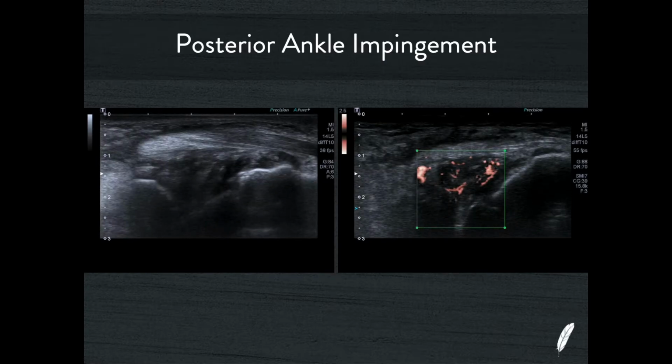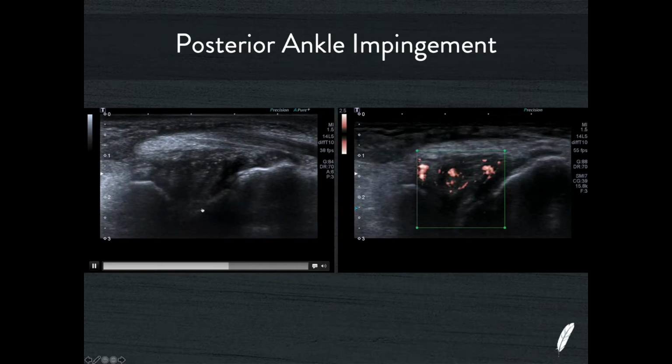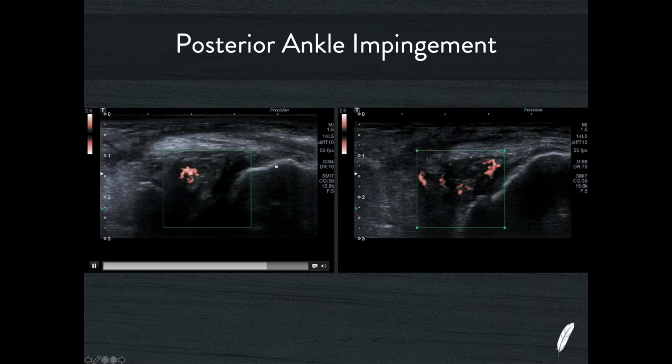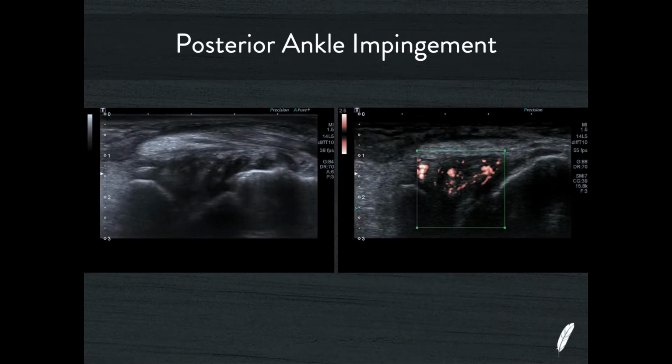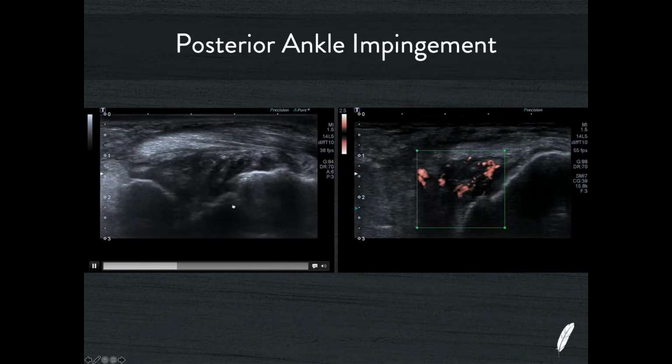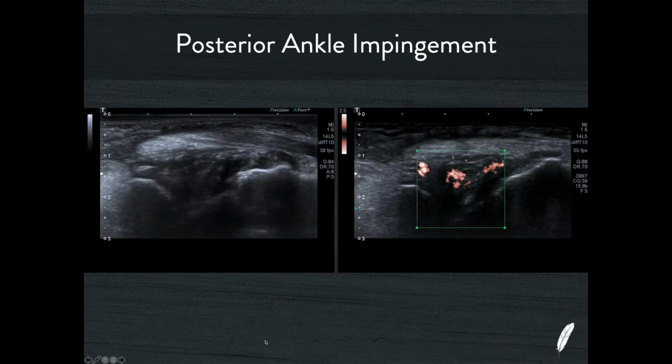And of course, you've got the patient prone. That's the tibia. This bone here is the talus. And then this is the calcaneum. And you can do dorsiflexion and plantar flexion, which will move the ankle joint. And that's what I'm doing here. If you do the scissoring motion, this joint here will move. And that's the subtalar joint.